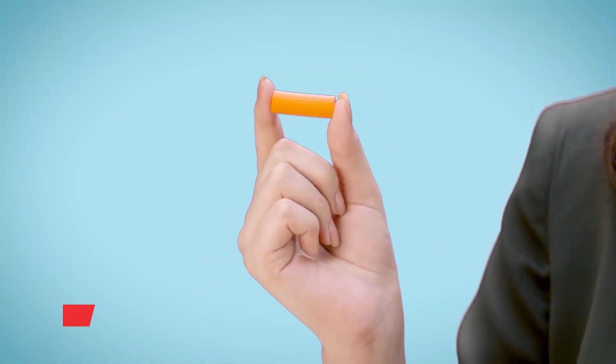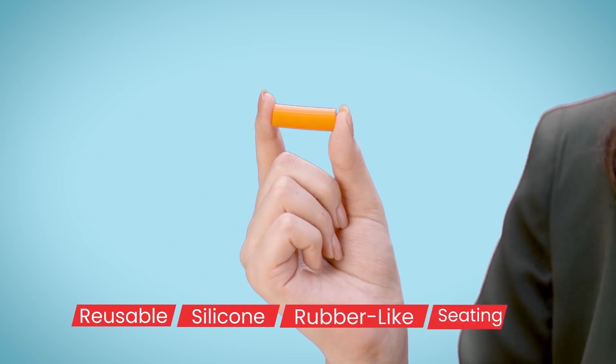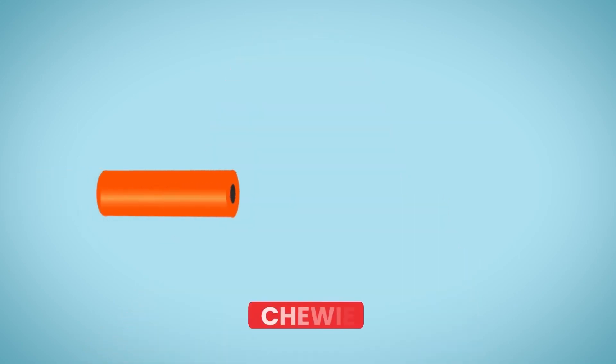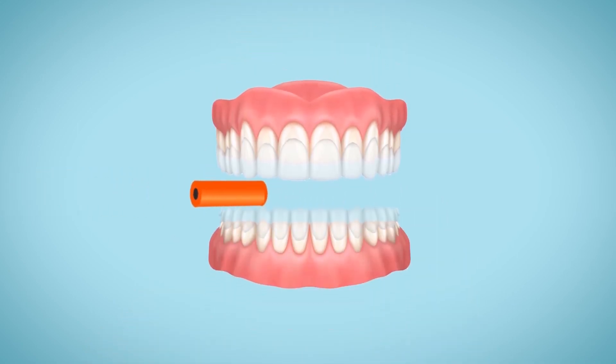This is a Chewy. It's a reusable, silicone, rubber-like material that helps in seating your aligners completely. Make sure you use the Chewy every day, every time you re-wear the aligners. This improves the fit of the aligner and aids the tooth movement.